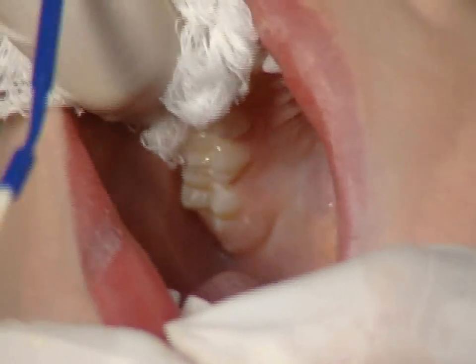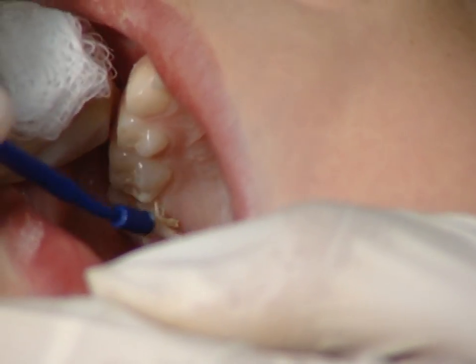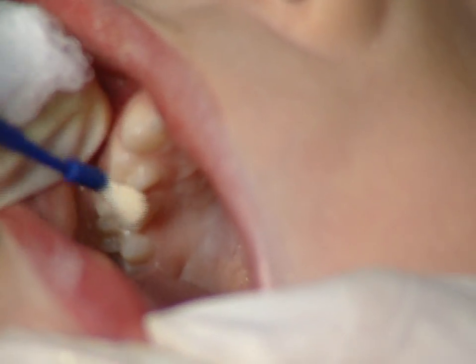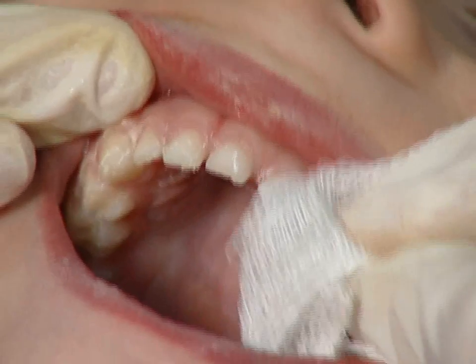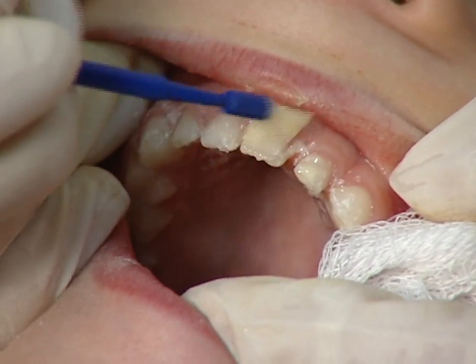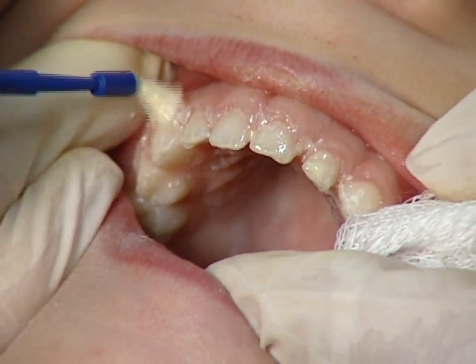As you paint on the varnish, make sure you cover all the tooth surfaces. Once the varnish is on, you do not have to worry if it gets wet, as it sets on contact with saliva. Paint the upper incisors last, so that you do not accidentally wipe off the fluoride varnish as you work in the back of the mouth.